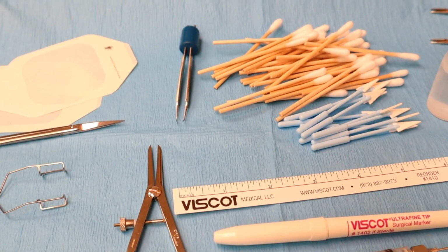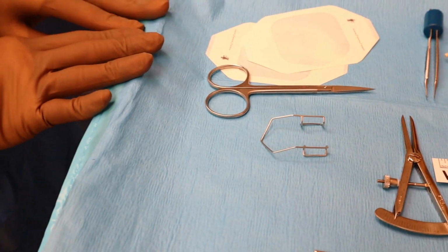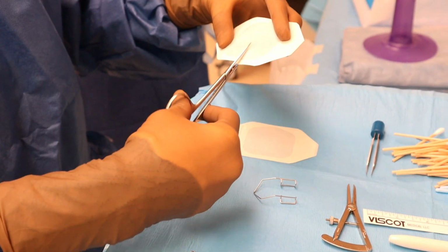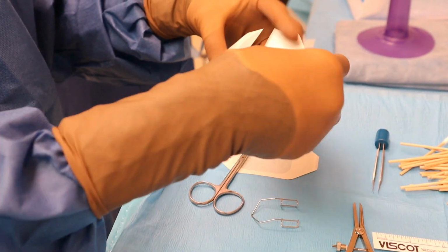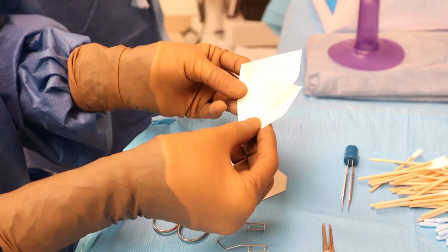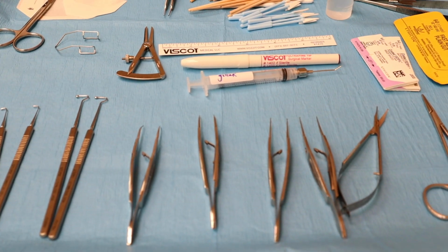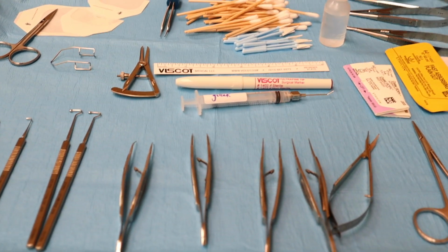But a lot of Q-tips, I use a lot of Q-tips. And then this is the Tegaderm that we use, and she's gonna cut it, basically to keep the eyelashes out of the way when we are doing surgery. We also do it for cataract surgery like that. So there we go, that's my Mayo stand, and I'm gonna get ready to go do surgery.